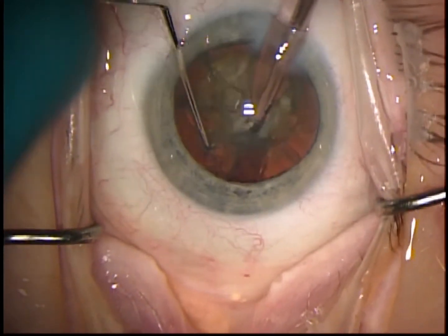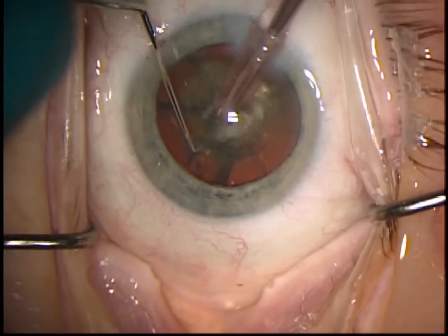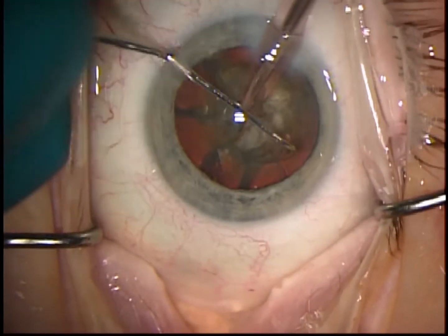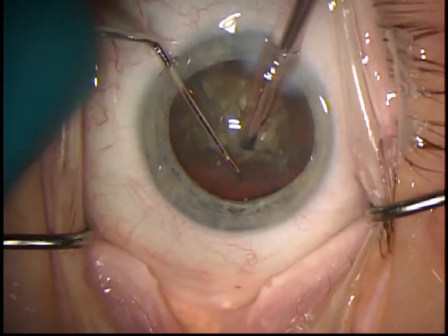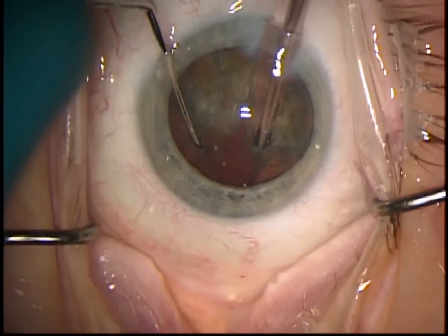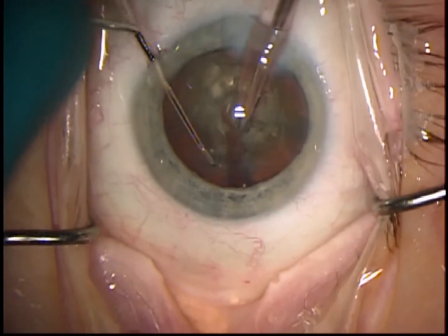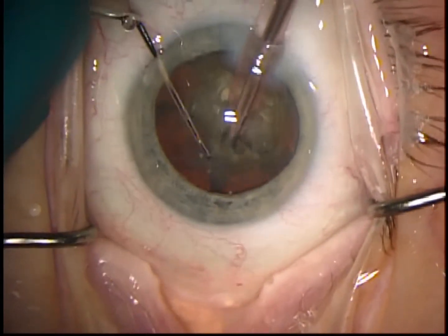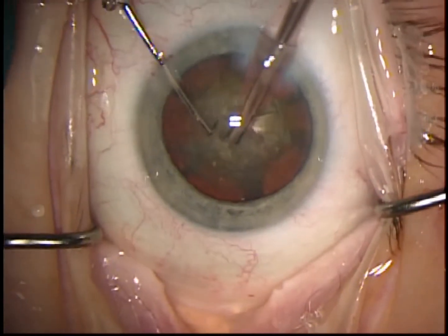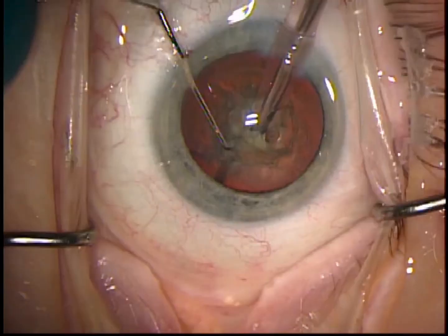You usually need to break into at least five to six segments. I try to make a smaller segment at the end because it's usually easier to take out a smaller segment than a larger segment. This is different than divide and conquer technique where you've already debulked the nucleus — you can divide into four pieces and take one of those quadrants out.